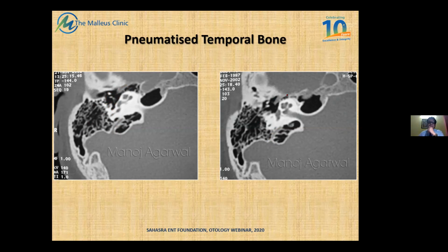Similarly, this is the tensor. This was the tensor here. So the facial nerve is here. But pardon me, I told you very categorically that we should always try and read the scans in a sequential manner, lest we might make a mistake. But obviously today we are discussing the pathologies, so the question of reading them in a sequential manner does not arise.